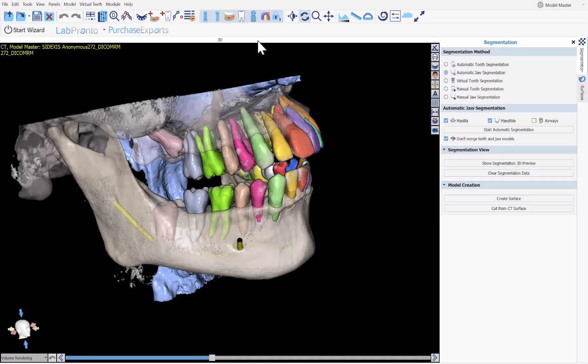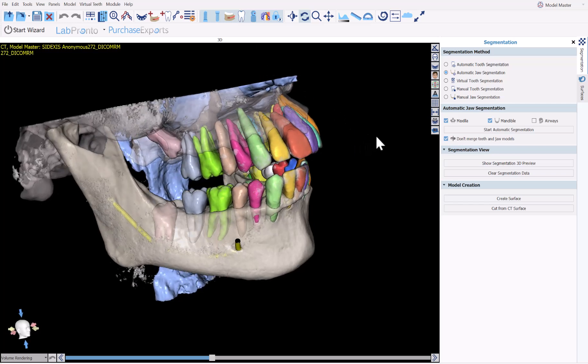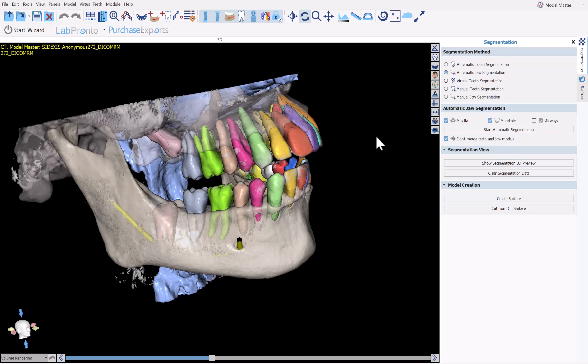Blue Sky Plan now includes fully automatic teeth segmentation, impacted teeth segmentation, jaw segmentation, and airway segmentation. The segmentations can be used and viewed throughout the software, including our surgical guide, model master, and crown and bridge modules.